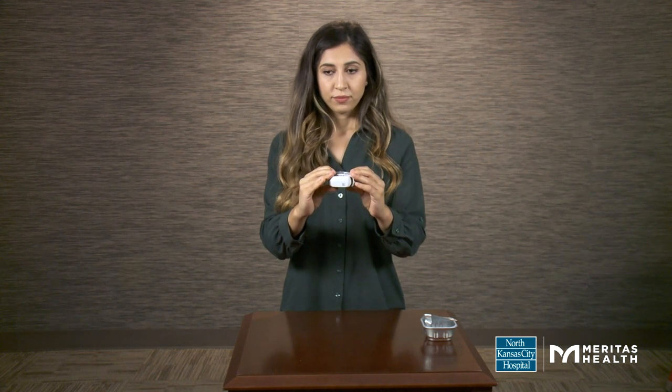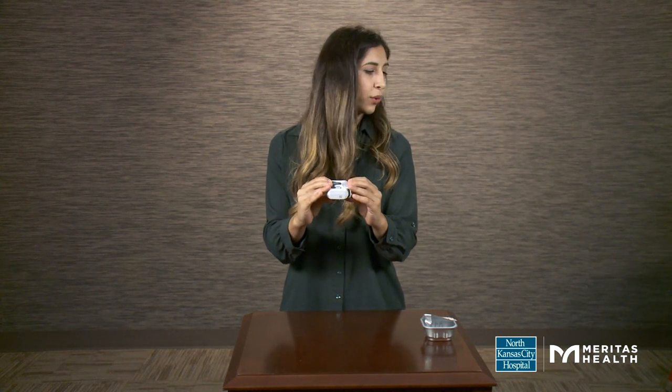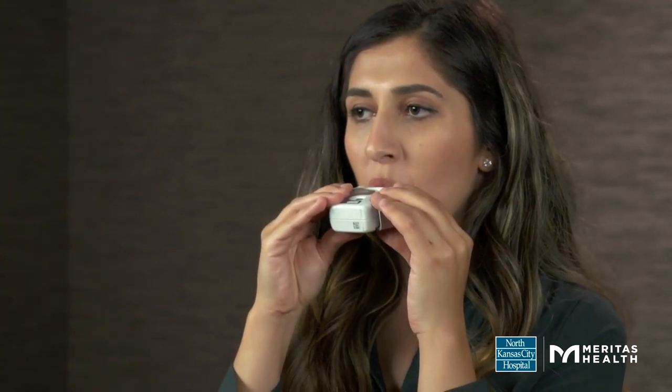Take a deep breath in and breathe out fully through your mouth, facing away from the inhaler. Put the mouthpiece in your mouth and tighten your lips around it. Inhale deeply through your mouth. Do not breathe through your nose.